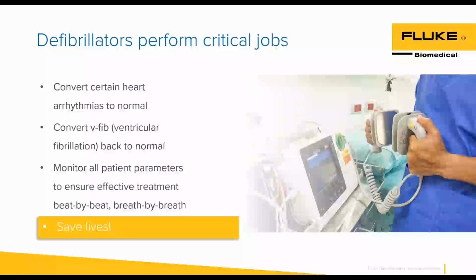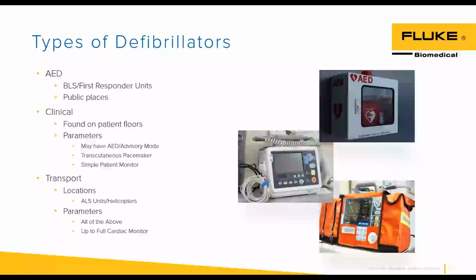And most defibrillators also have the ability to obtain important patient vitals, and that's even more important in certain environments where you don't have a full operating room full of equipment.